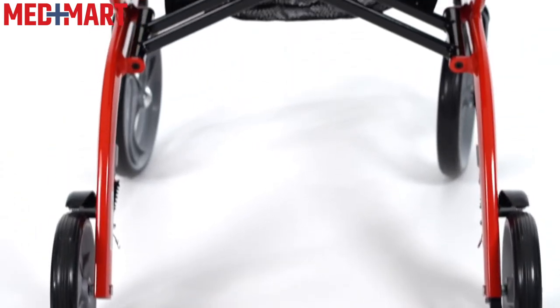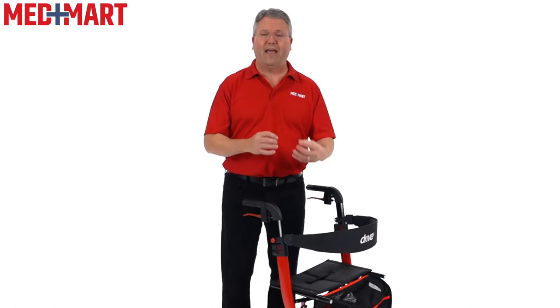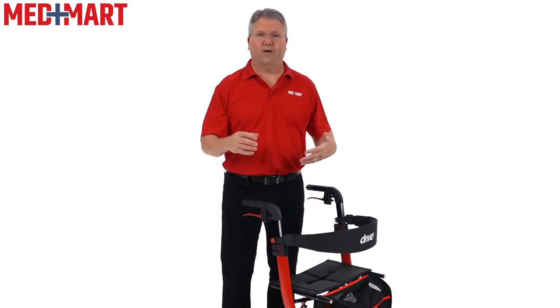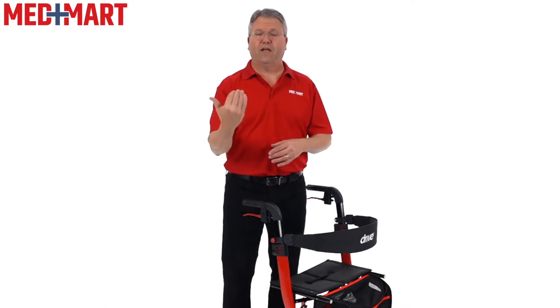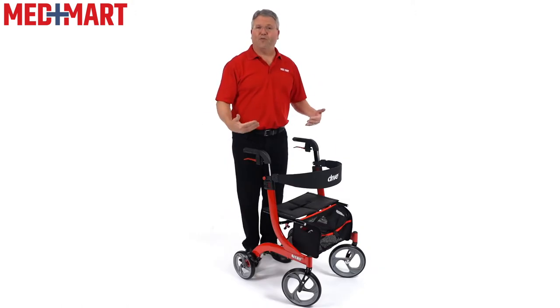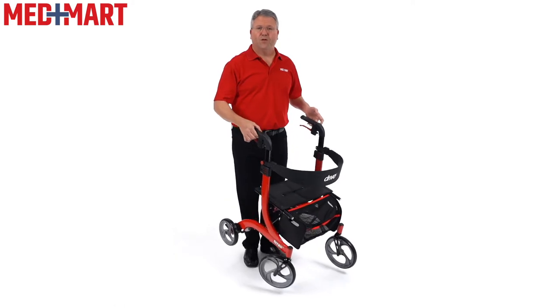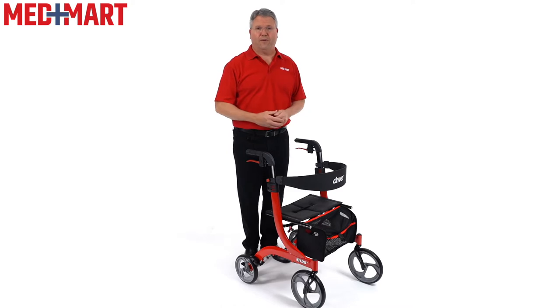The Drive Nitro Rollator features a lightweight aluminum frame, and what makes this frame really special is the fact that the cables are actually inside the frame versus on the outside of the rollator. In most rollators, the cables are on the outside, which has some potential of getting caught in something or getting broken. Because of the aluminum frame, this comes in an impressive 17 and a half pounds, which makes it very easy to manage and travel with. It also features a weight capacity of 300 pounds.